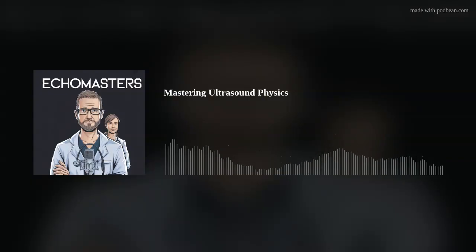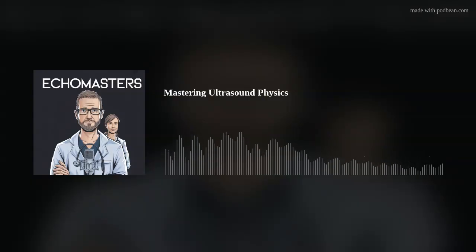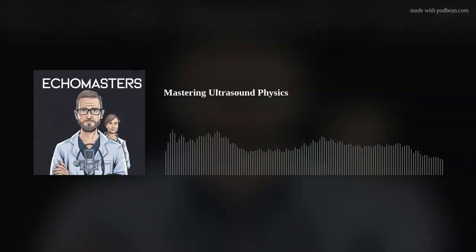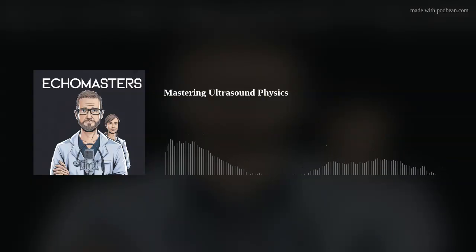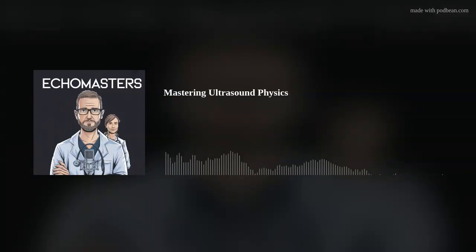And 4D. That just sounds like science fiction. Well, 4D is basically 3D, but in real time. Like a video. Precisely. It adds the dimension of time to 3D, so you're watching that reconstructed 3D volume move live. Wow. What's that used for? Dynamic assessments. You could watch a baby moving in the womb in 3D, or see a heart valve opening and closing in 3 dimensions, or analyze complex joint motion. So 2D is the everyday tool, but 3D and 4D offer these extra incredibly detailed insights, either spatially or dynamically. That's a good way to put it. They definitely enhance our diagnostic capabilities, although they usually require more advanced machines and sometimes more time.